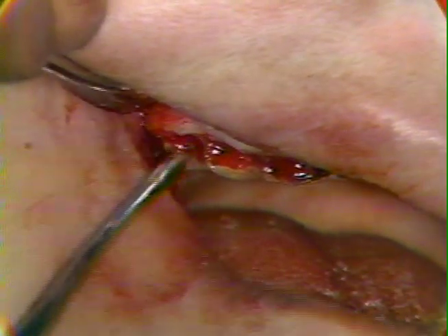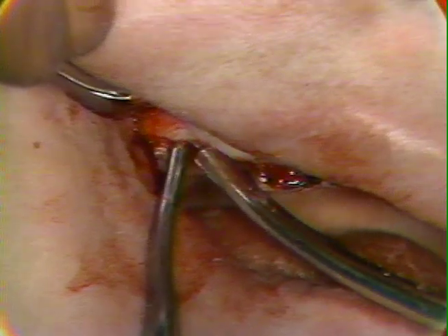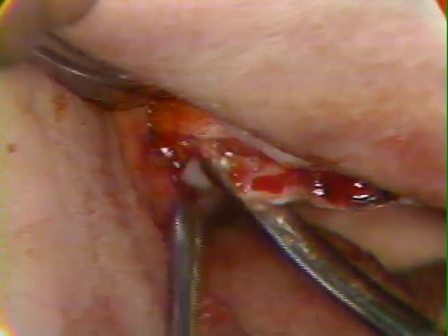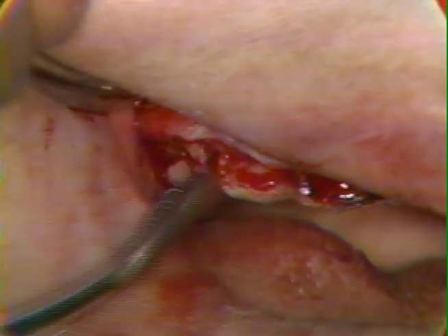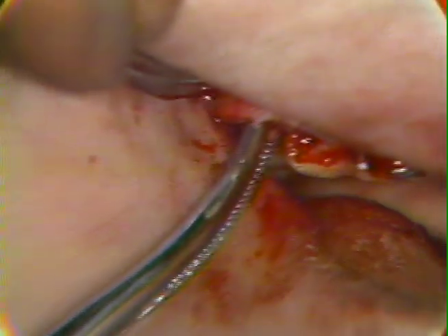We can suction again. I'll see if I can find that mesial buccal root, which is right here, and we'll rotate that in a manner that will cause it to deliver. We can see the edge of it being turned to distal, and we'll see if then we can grasp that and remove it with a conservation of the buccal plate, which is the whole objective of division of roots.